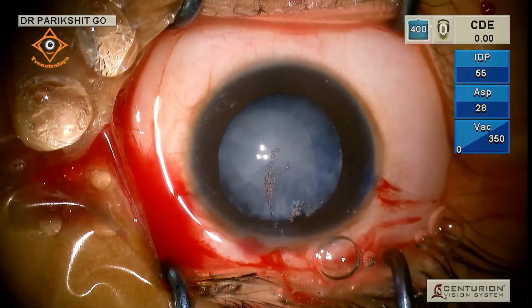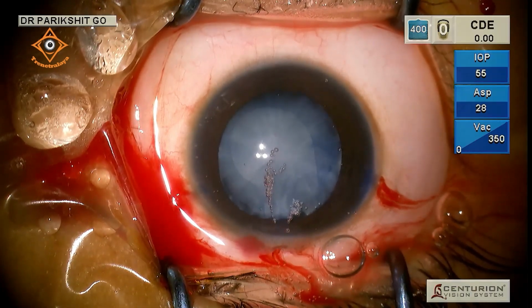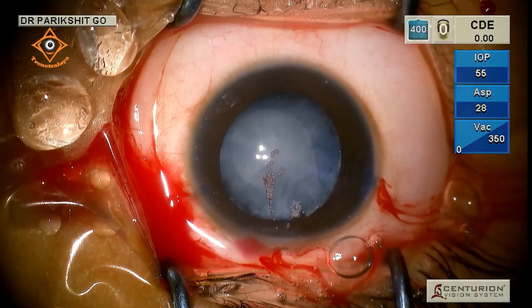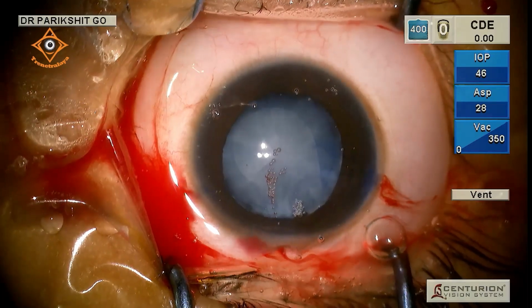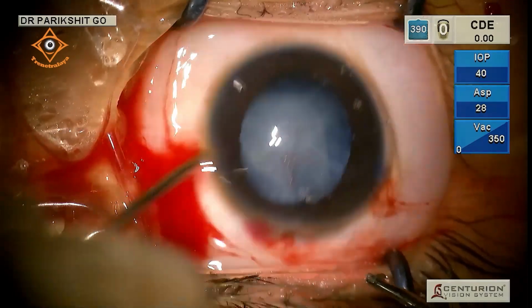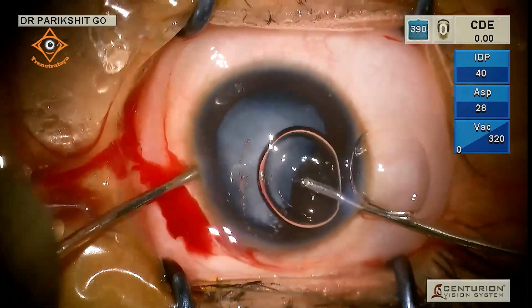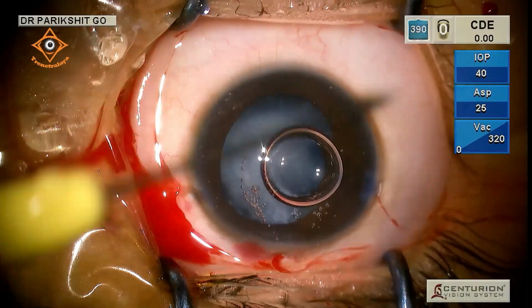Now, in a pediatric cataract, it is the anterior capsule and the equator from which the new cells are set up. So once we have taken care of the cataract, we should see to it that we polish the rim of the anterior capsule well, and polish the equator very well, because that is from where the new cells will be coming out. I will need a side port again, and a visco, please.